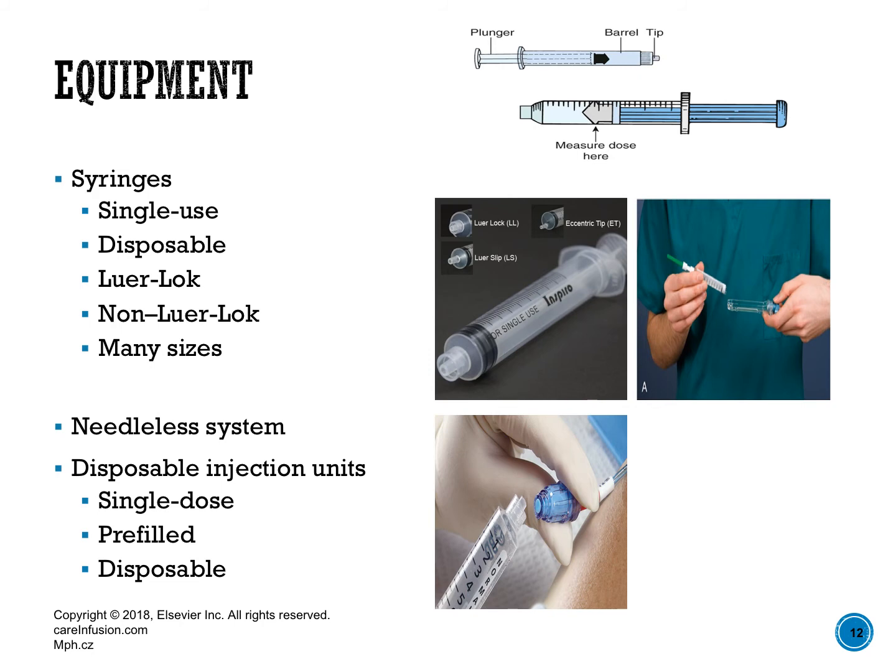You want to remember to take out all of the air from the syringe, even the little small tip should not have air in it. We don't want to introduce air into the patient's vein.